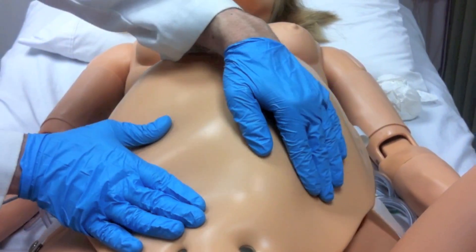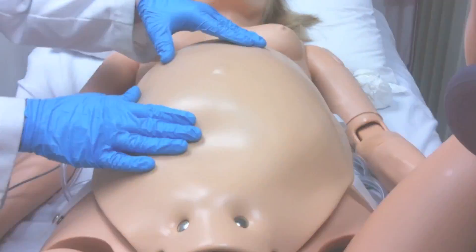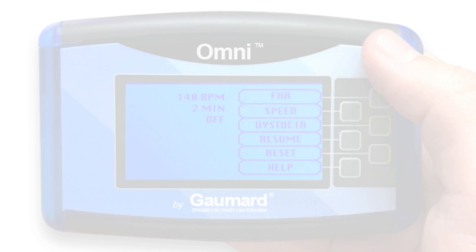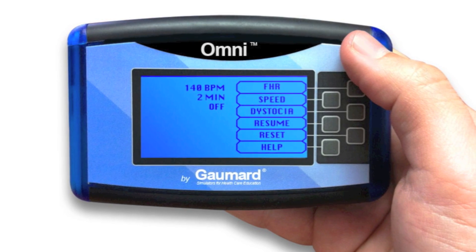Once ready to begin the Leopold maneuvers, you should determine if the head is up or down by palpating the spine, elbows, and knees. NOEL is operated by the Omni controller, which manages both delivery and CPR monitoring functions.